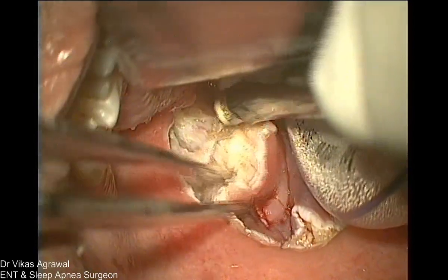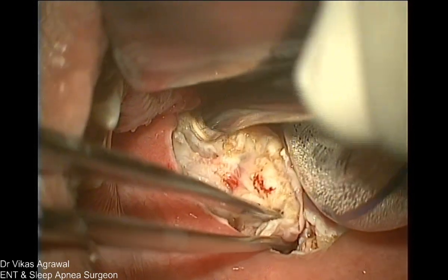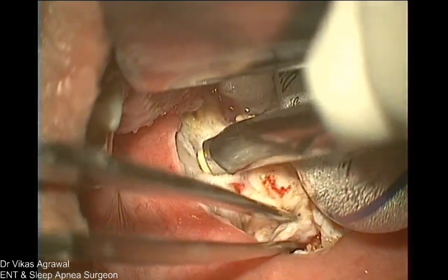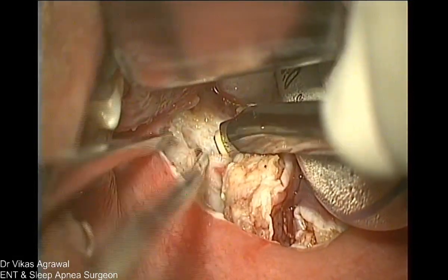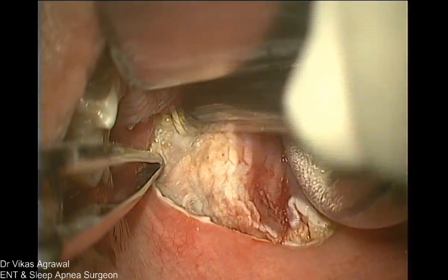Okay, and you can see one more vessel here. Can you see this? Yeah. So I'll coagulate that in the whole extent. That was an accident, so need not bother. We know what to do if it happens. So that was just an accident. Our aim is not to expose the tonsillar artery. We know that the tonsillar artery was there.